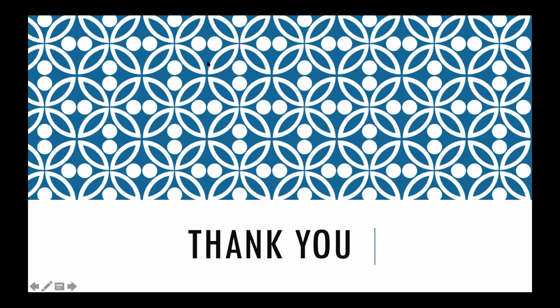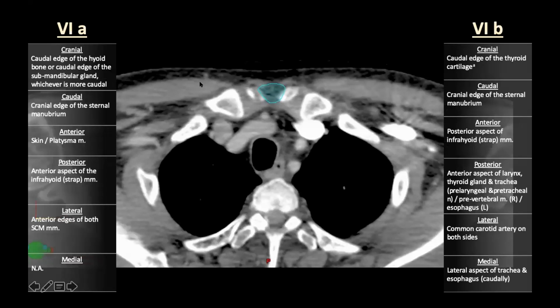The first question is, in case of level 2 positivity, when you said that level 7B has to be included when the upper level 2 node is positive, how do you delineate that? How do you differentiate a lower and upper level 2? Is there a clear anatomic or radiologic limit to calling a positive node as upper level 2?